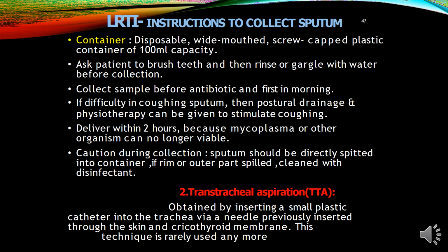Instructions to collect the sputum: the container should be a disposable, wide-mouth, screw-cap plastic container of around 100 milliliter capacity. Ask the patient to brush the teeth and rinse or gargle with water before collection. Collect the sample before antibiotics, the first one in the morning. If difficulty in coughing is seen, then postural drainage and physiotherapy can be given to stimulate coughing. Deliver within 2 hours because Mycoplasma and other organisms do not live longer. Caution must be taken during transportation and collection of the sample to avoid spillage.